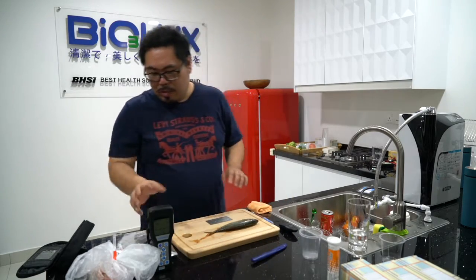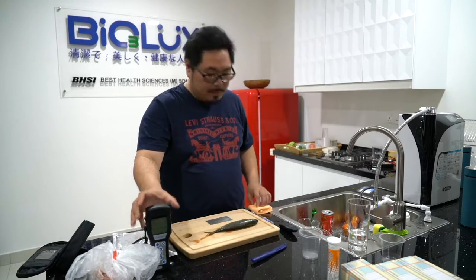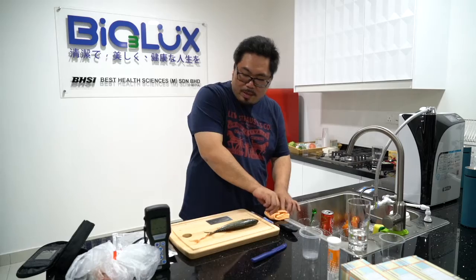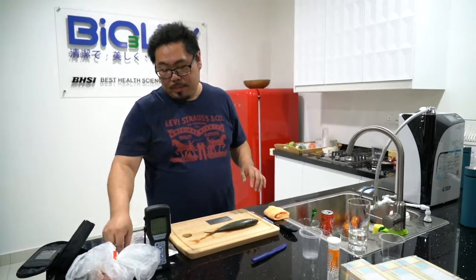So, this is called Hygiena ATP. It measures the amount of ATP in bacteria's DNA.